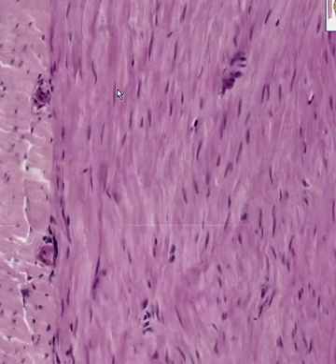If you are looking at smooth muscle fibers which have been cut transverse to their longitudinal axis, they'll look round. If you cut them longitudinal to their longitudinal axis, they will look like little cigars or very spindly. Quite frankly, you could have a very hard time differentiating this from a connective tissue, perhaps dense, regular, or irregular connective tissue.